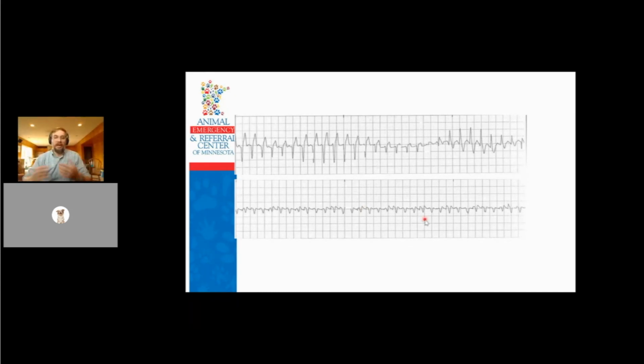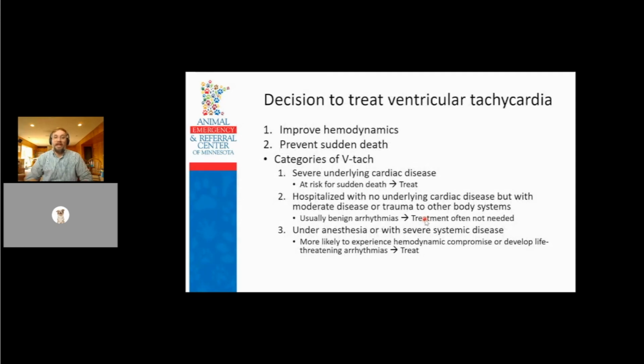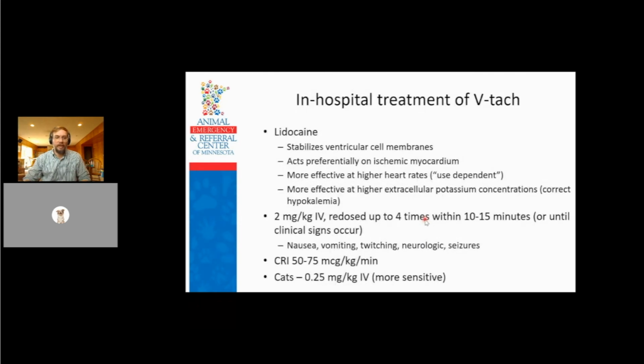And this did eventually lead to ventricular fibrillation. So this is the concern when we start to see these couplets, triplets. It may not be hemodynamically unstable, but we're worried that it's going to become electrically unstable.